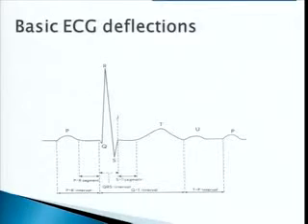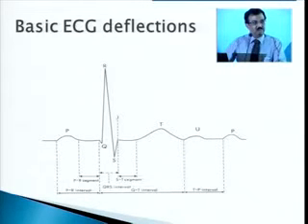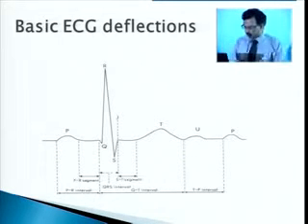Good afternoon, dear friends. At the outset, I thank Dr. Prabhakar for giving me an opportunity. I'm talking today about the basic ECG deflections, and most of this all of you know very well. It's very basic, and I think we read it in our first MBBS physiology Guyton textbook.